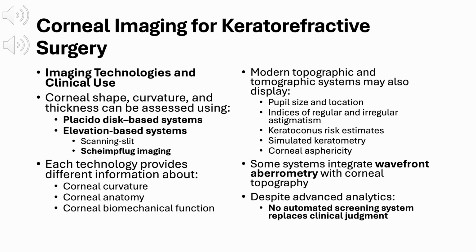Now we'll shift into corneal imaging and why it's so central to keratorefractive surgery. The goal of corneal imaging is to understand corneal shape, curvature, and thickness in a way that helps guide surgical decision-making. This is done using several different imaging technologies, each of which provides a different type of information. Corneal shape and curvature are commonly assessed using placido disc-based systems, which analyze reflections from the anterior corneal surface, and elevation-based systems, which measure the cornea in 3 dimensions.